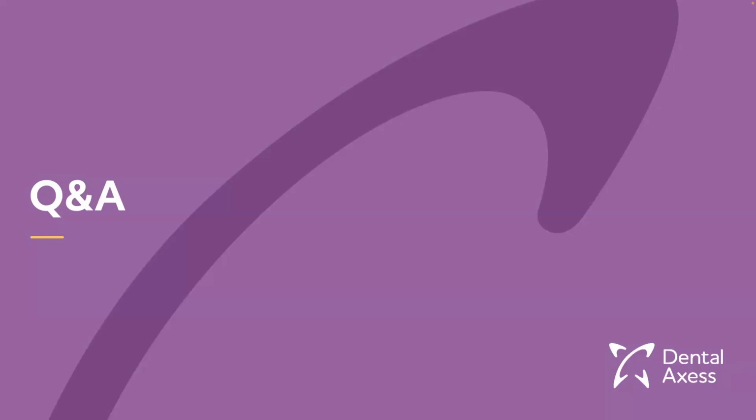The pictures, on the other hand, are very important because sometimes one of the requests from doctors sending cases is to improve midlines. But if I don't have the picture of the midlines, the smile picture, I don't know which one is correct and which one is not. I always base it on the upper being the correct one.